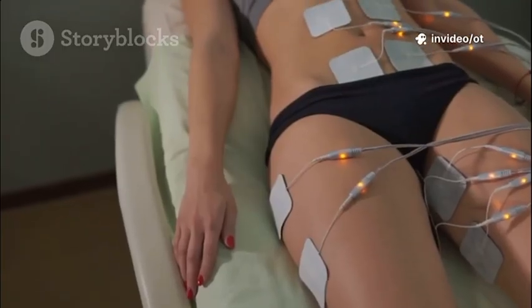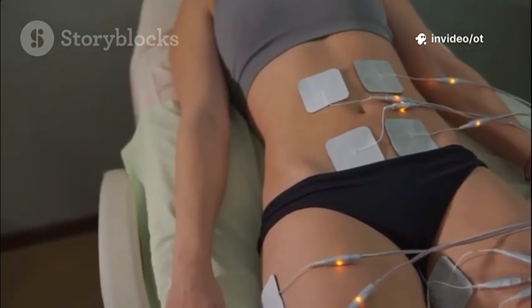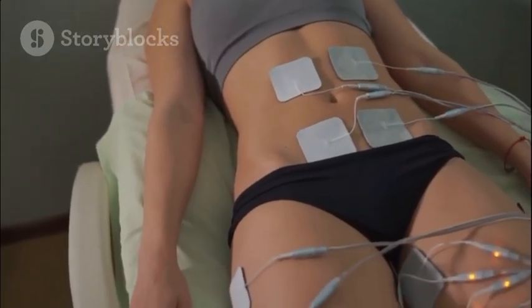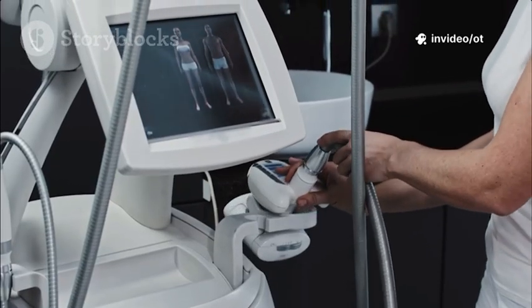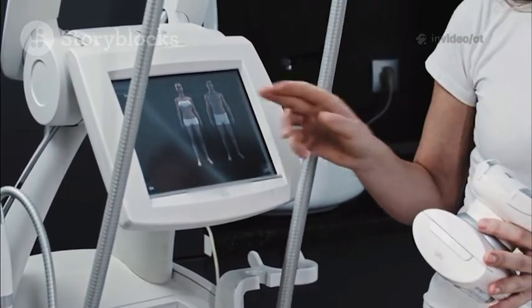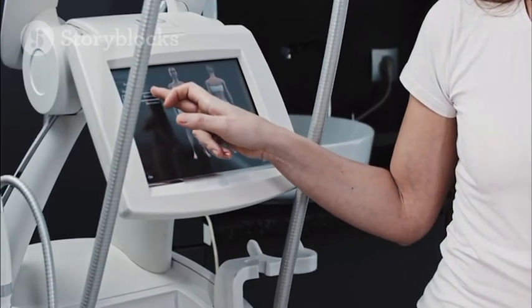For knee osteoarthritis with deep joint line pain and capsular tightness, 1 MHz continuous, 1.0–1.5 W/cm² for 8–10 minutes, covering medial and lateral joint lines. While tissue is warm, perform patellar and tibiofemoral mobilizations, followed by low-load prolonged stretches into flexion, extension. Then progress to functional strengthening like sit-to-stands and mini squats.